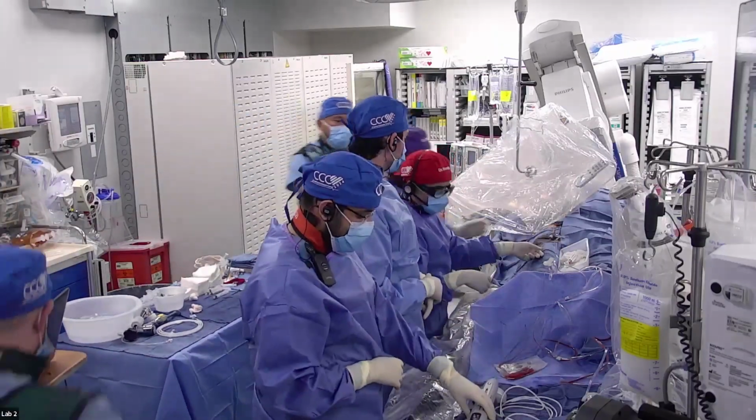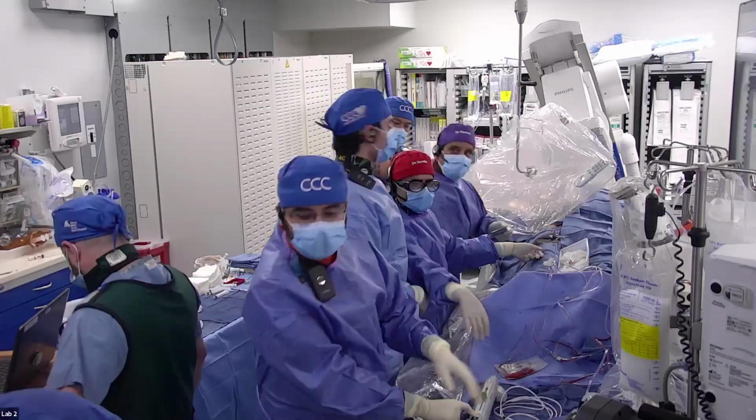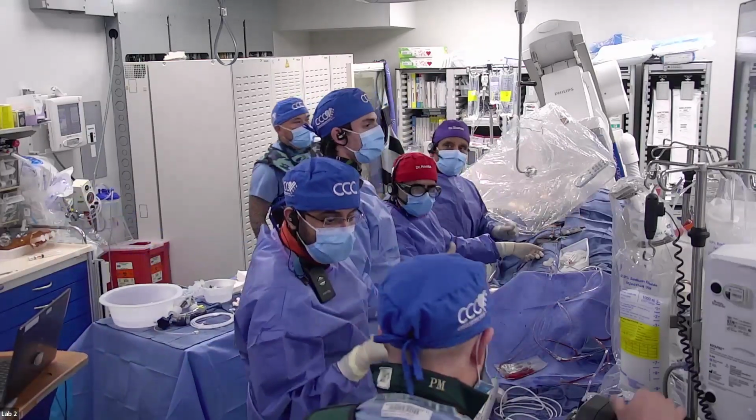Okay, how are we doing now? Can we see? Close the flush for the time being. Not yet. Okay, can you see us? Yeah, we still see Dr. Kinney here. Can we please go to Dr. Sharma's lab?